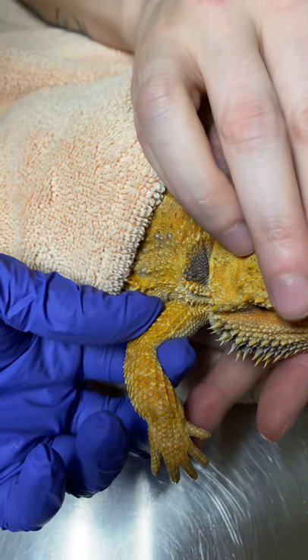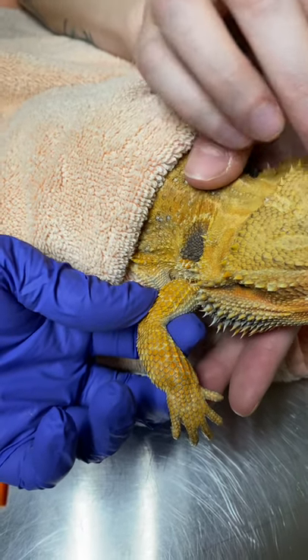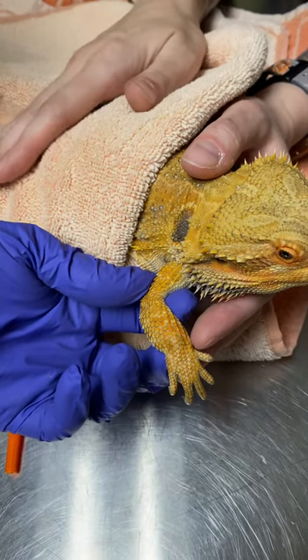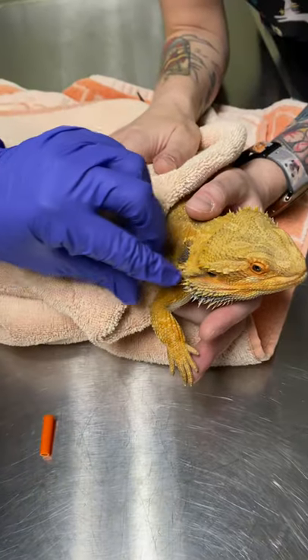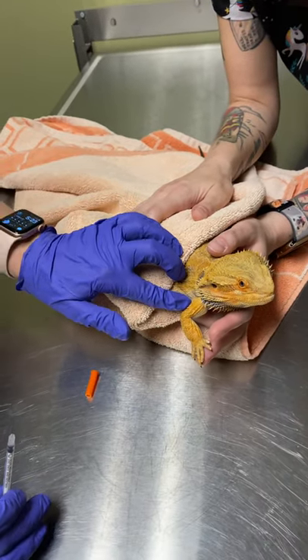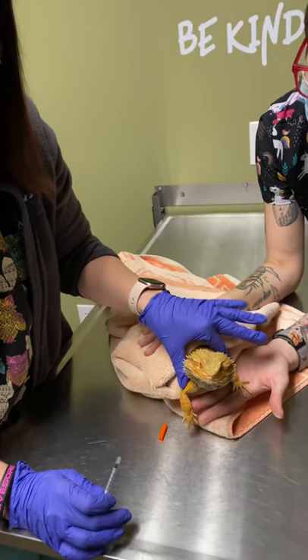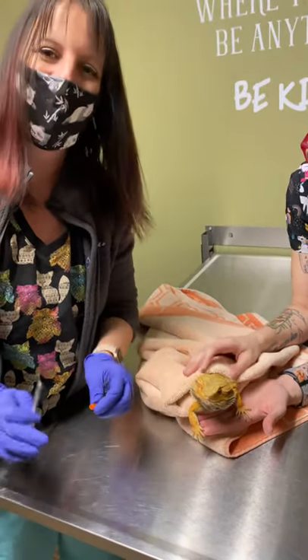I use my finger afterwards. A little bit of blood can come out — that's normal. If you were to pull back and get blood, you want to take the injection out and relocate to a different area. He did so good for that injection. The next injection you give, you're going to go on the other leg. We only do the front legs in reptiles, not the back legs. If you have any questions, give us a call. Thanks, bye.